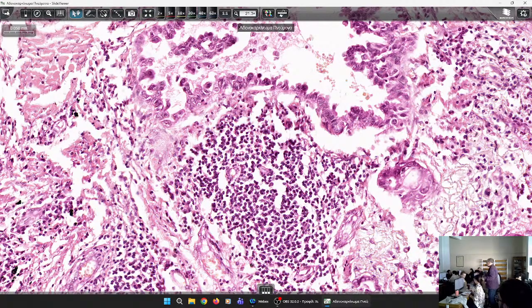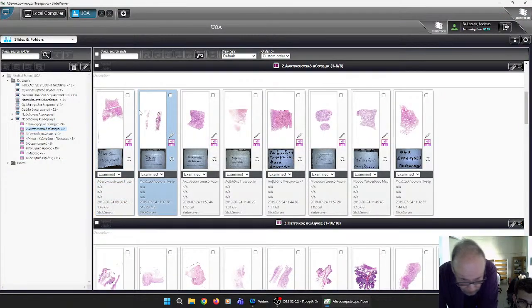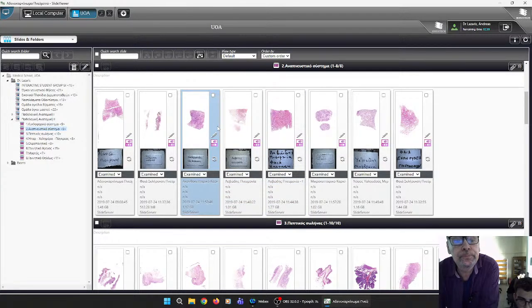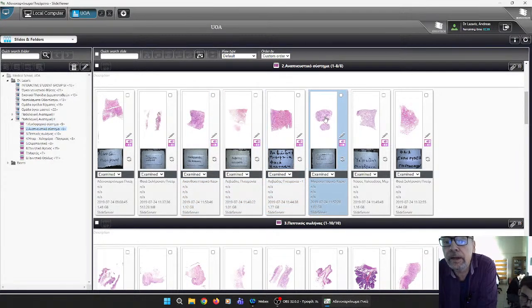We'll see how it goes now with the small cell cancer, which is not so difficult to study because all malignant cells have a common determining feature. Let's have a look at the small cell cancer, which I want you all to open in your virtual slides. Here it is. This one. This is the one, the small cell. You look at it, which slide it is?